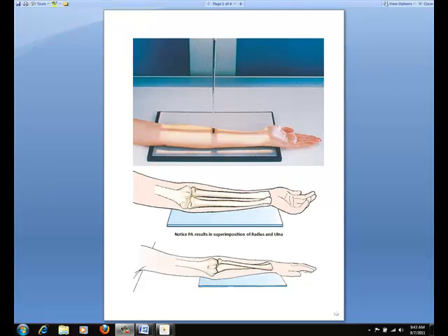For the AP projection of the forearm, seat the patient close to the radiographic table and low enough to place the entire limb in the same plane. You want to be sure to supinate the hand and extend the elbow until the forearm is in a true supinated position. Because the proximal forearm is commonly rotated in this position, palpate and adjust the humeral epicondyles to be equidistant from the IR. Notice this is an AP projection.